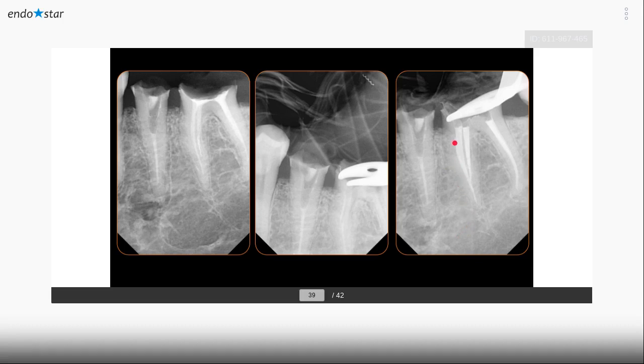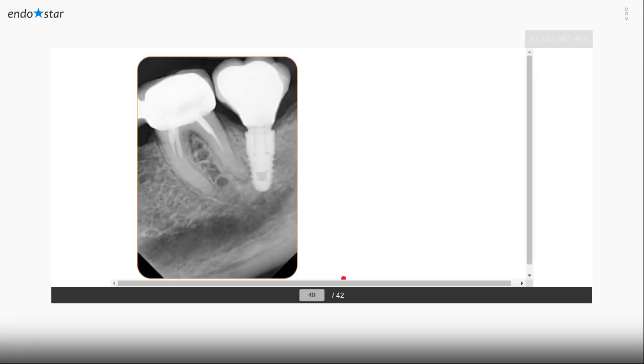So what you can see in a mesial buccal aspect, we were removing more dentin, because there was a ledge. Now I will tell you in the next case how we can bypass the ledge. So this case is here. What we can see, again, resorcinol. So it's like Russian red material. So it's rather stiff, rather rigid, and rather tough material.